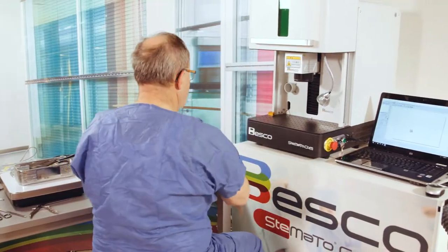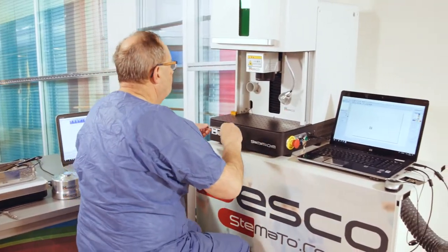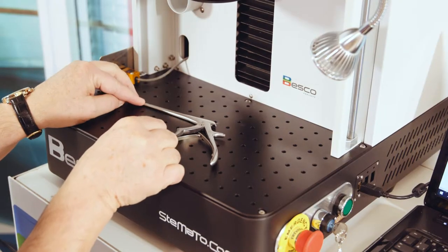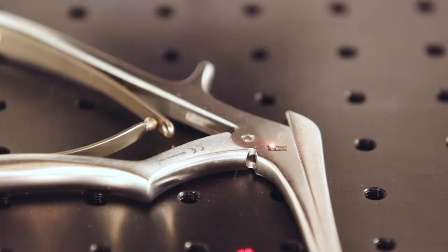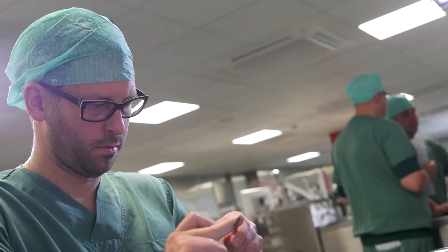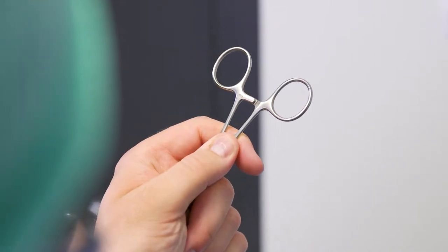In Stemato, tracking on instrument level is possible. Every instrument will be marked with a unique data matrix. The marks are durable and safe.